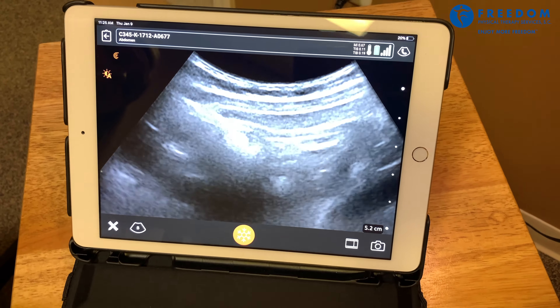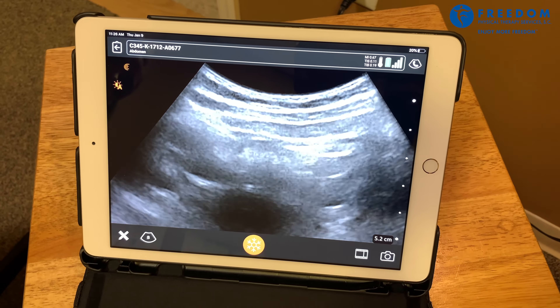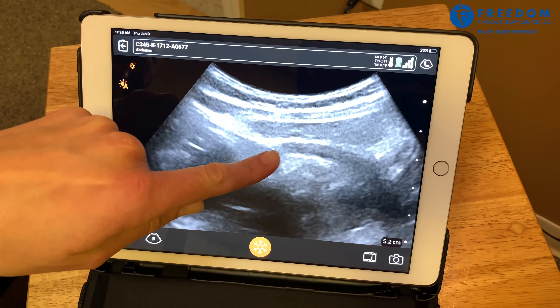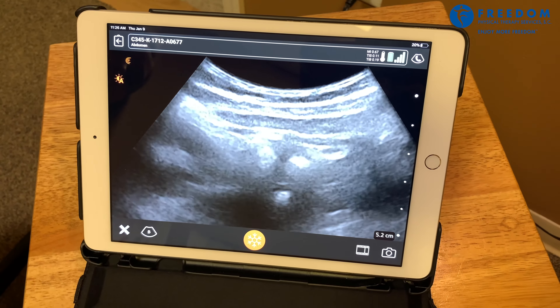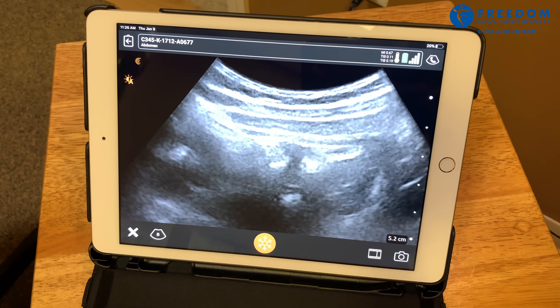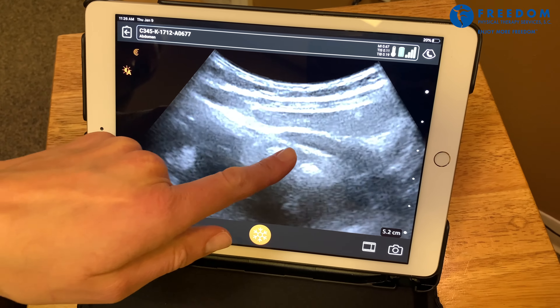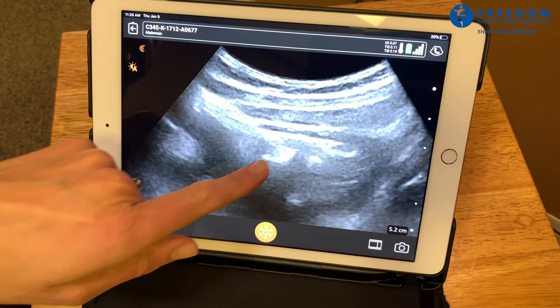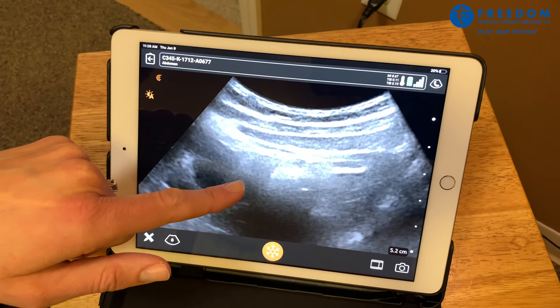The white lines are separating the muscles. So I'm going to have you go ahead and contract your transverse abdominus. You can see right there, this muscle got nice and thick and it moved over to the right side of the screen — which is a beautiful job. Go ahead and contract the transverse abdominus again, and you can see that same movement, a nice contraction.